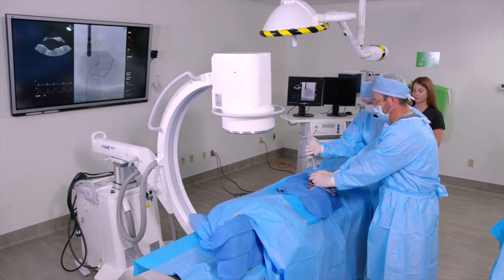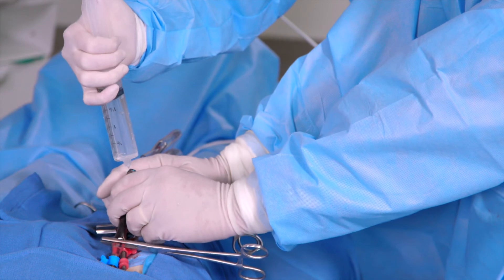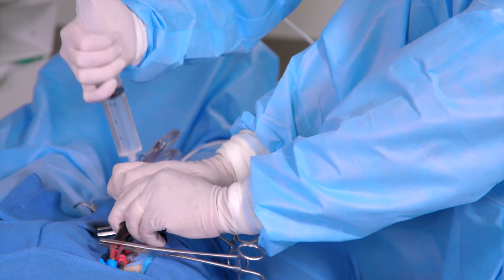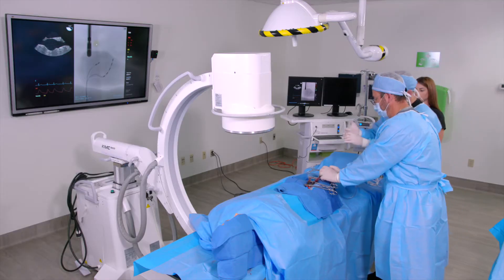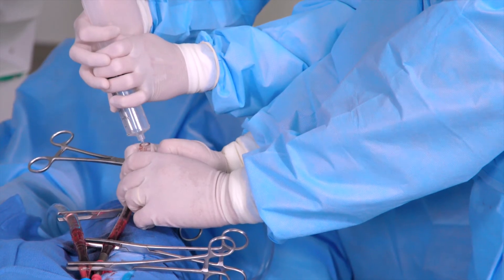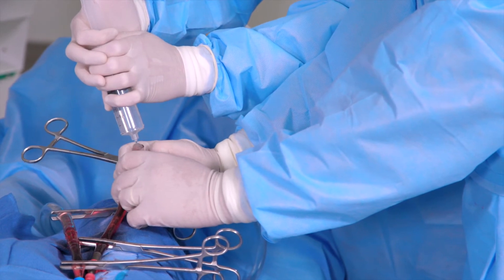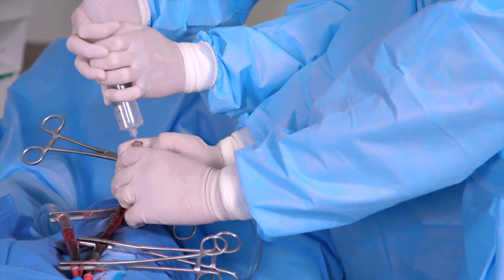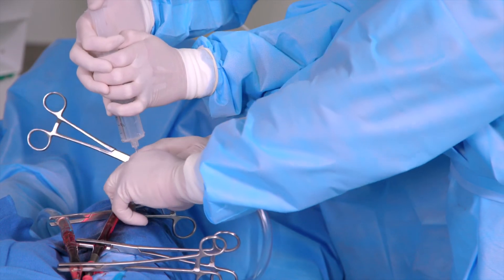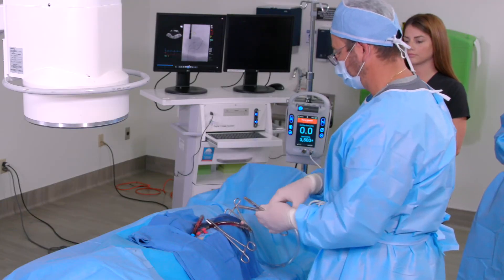Connect the pump inflow tubing marked with a blue stripe to the transeptal cannula using a wet-to-wet connection. Connect the pump outflow tubing marked with the red stripe to the arterial cannula using a wet-to-wet connection. Once you have confirmed that all of the air has been removed, insert the tubing over the second barb of the tubing connectors. Once again, inspect the circuit for air.